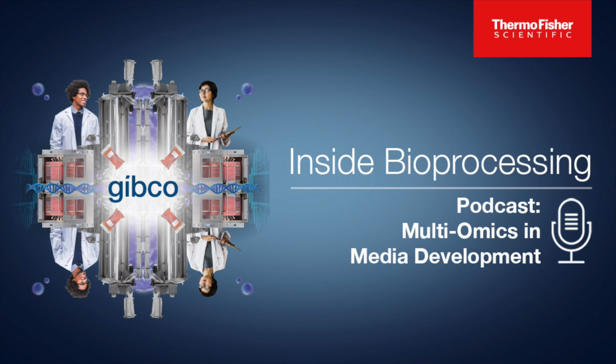So it'd be great, Paul, for you to first start and explain why is detailed analysis so important during the media optimization process? Certainly, anytime you are developing a medium or feed, one of the things that you need to account for is how each metabolite within that medium or feed is going to be utilized. And so to do that, we need to get very detailed analysis of the bulk metabolites that a cell line would use, such as amino acids, carbohydrates, the vitamins that would be utilized.